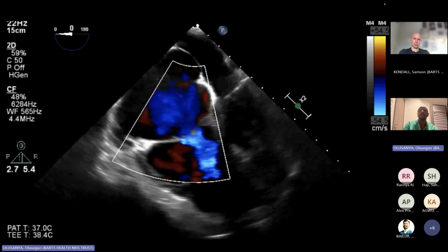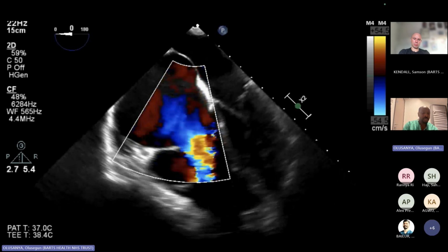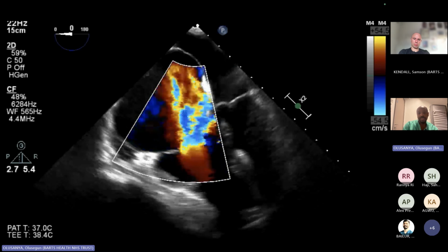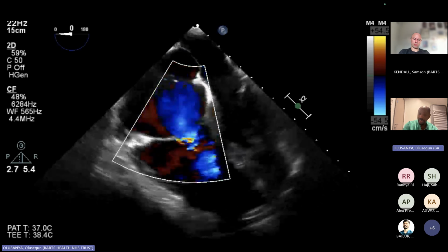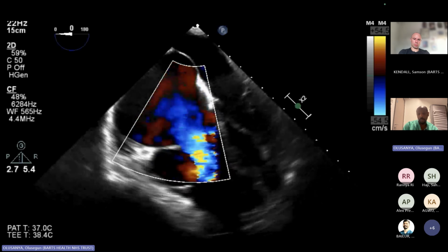That's what the original paper from Solini and Deneau did. And that's what VExUS will be continually correlated with. Because when you have right ventricular dysfunction and you have an elevated right atrial pressure, that is what translates into downstream venous congestion that you can assess by VExUS. Using VExUS as a volume status monitor blind, which is what people are trying to do, is a road to madness, and we should stop doing that.